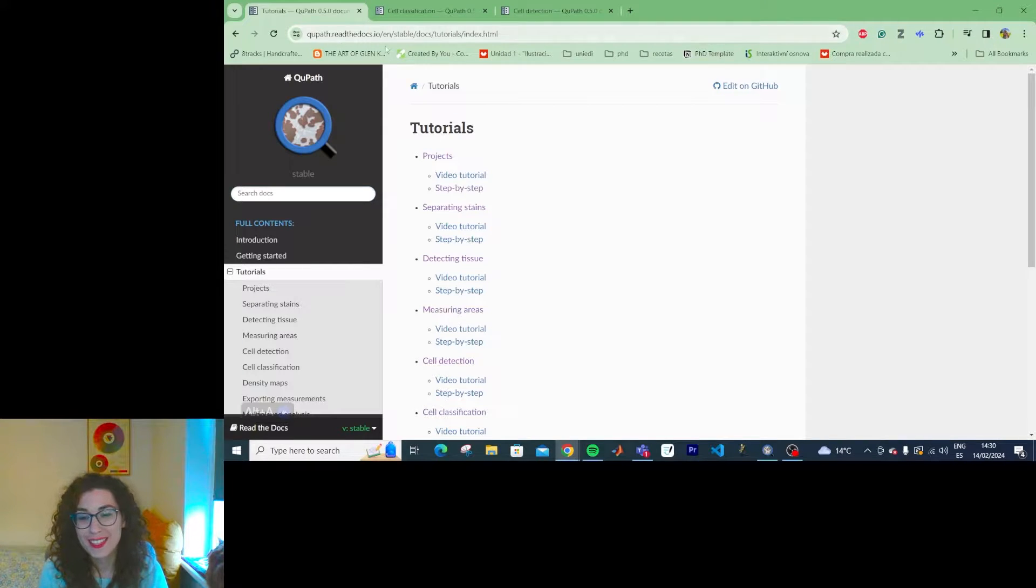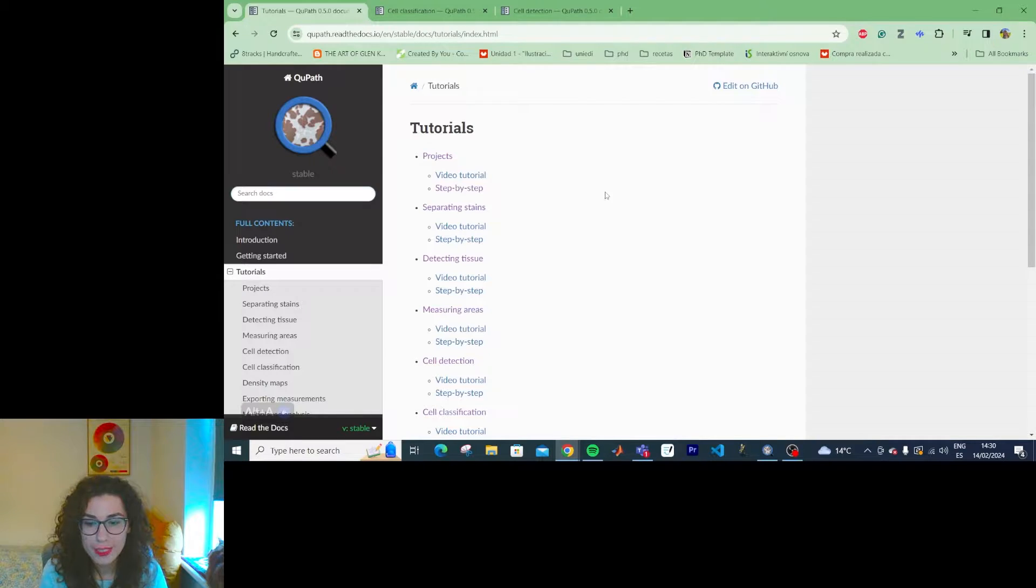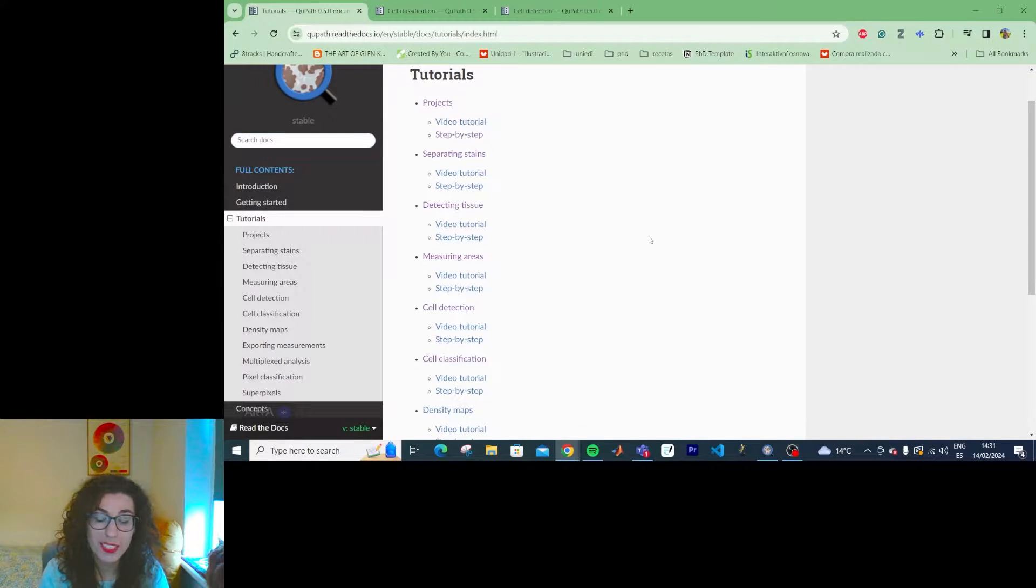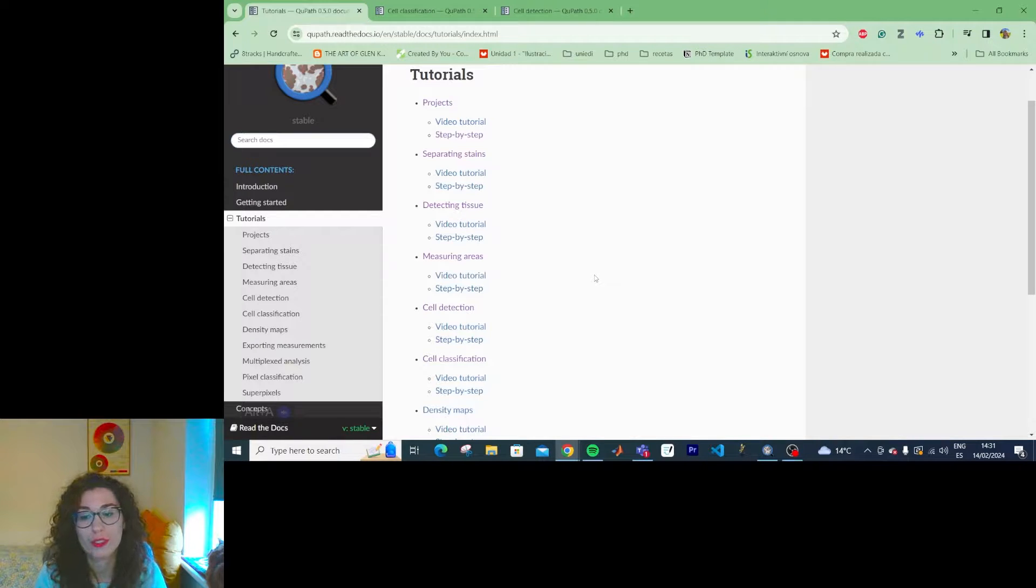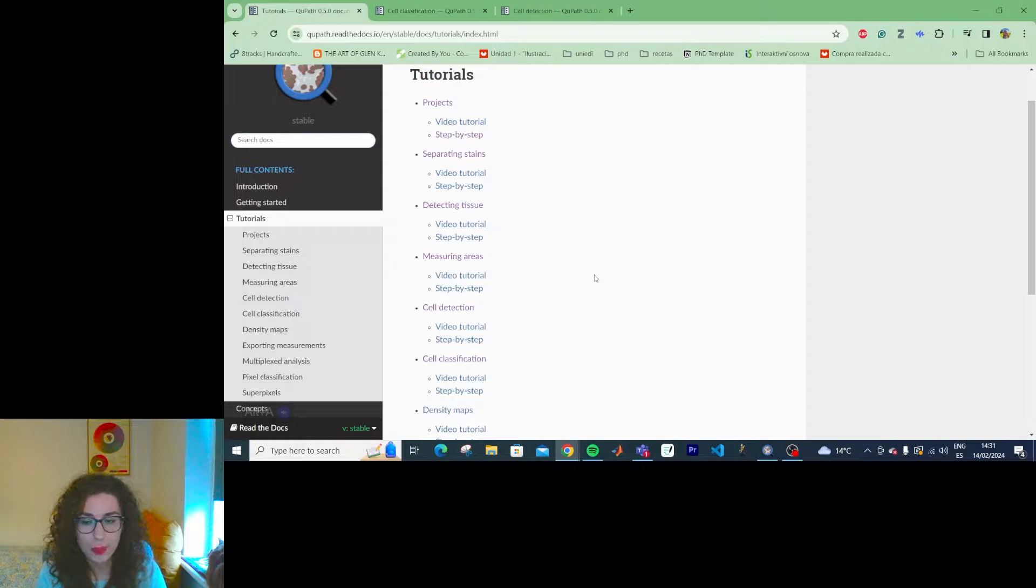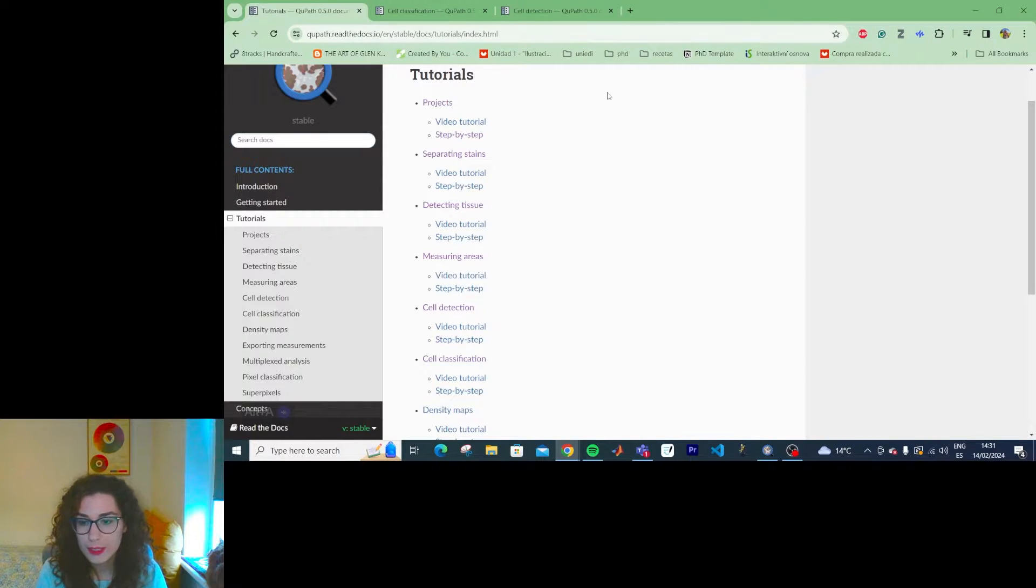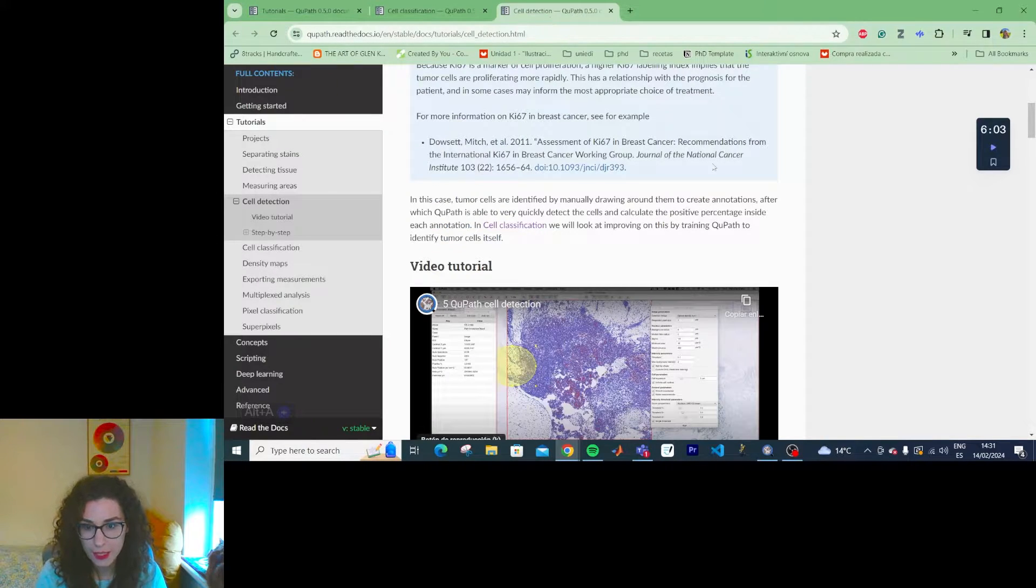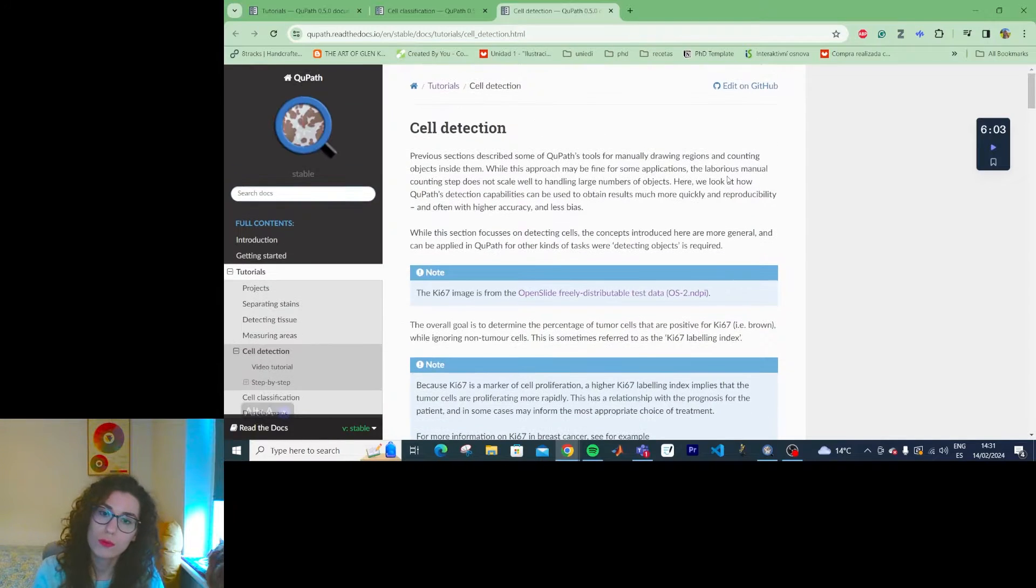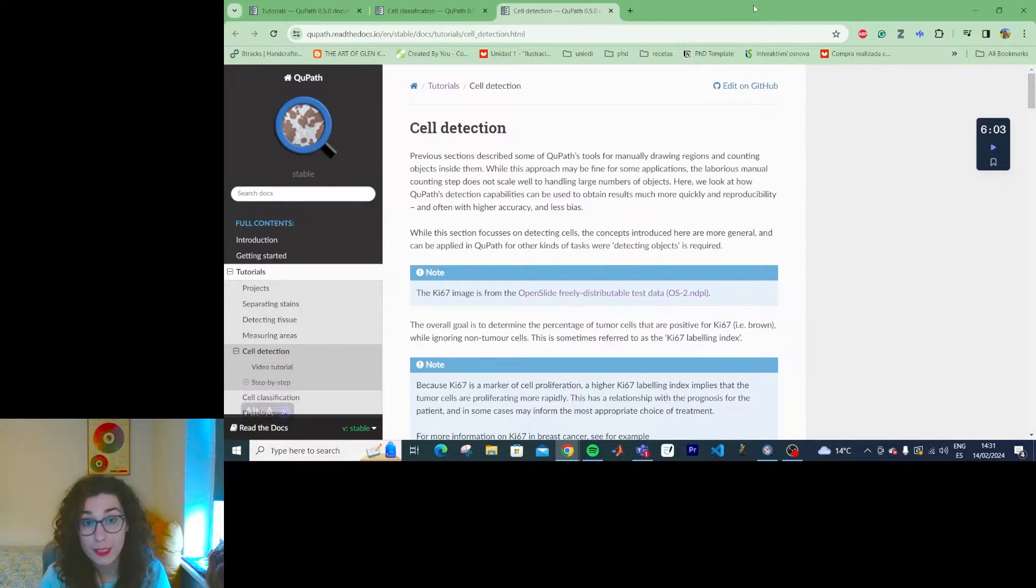Hi everyone! Today I wanted to follow the cell detection tutorial but then I went in and apparently the cell detection and the cell classification tutorials are very similar. So this video is going to be a mix of both. We're going to start with the cell detection one and then go right through to the cell classification one.